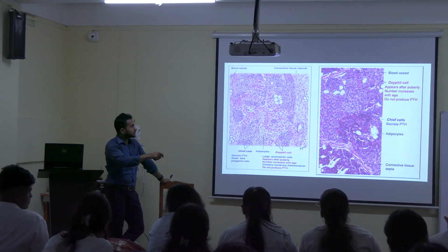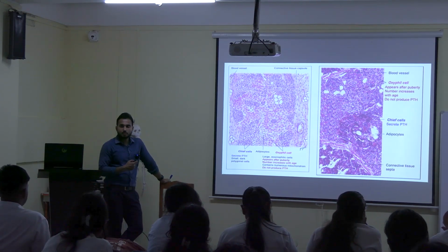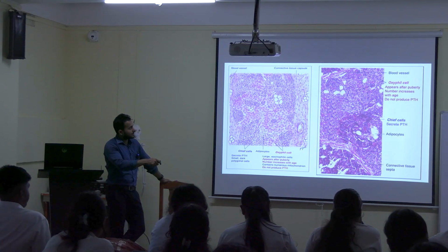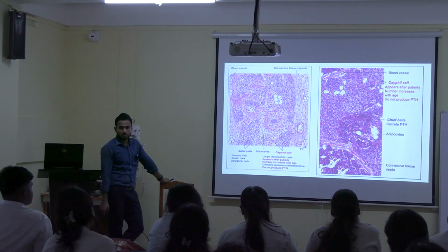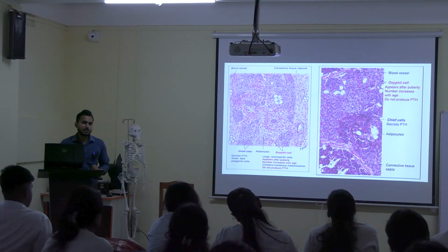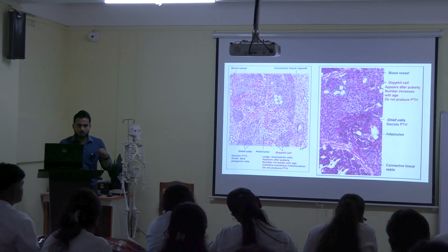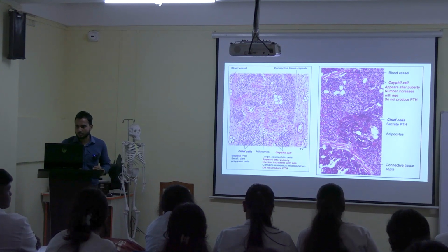Next, this is the original diagram, or the low magnification image of the parathyroid gland. Here, how will you identify the oxyphil cells and how will you identify the chief cells? See the appearance of the chief cell and the appearance of the oxyphil cell. Staining difference is there. Clearly you can see the chief cells and the oxyphil cells. In the oxyphil cells, lipofuscin is a yellow colored substance. As age increases, the amount of lipofuscin increases. It denotes that the cells are getting older.